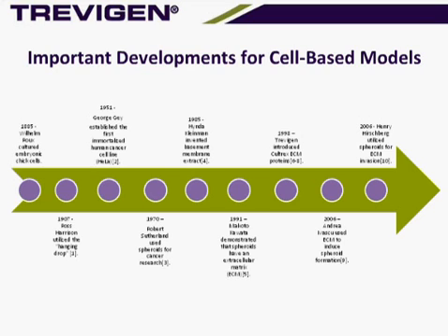Next, in 1985, Hynda Kleinman invented basement membrane extract, also known as Matrigel. This is one of the most commonly used reagents for organotypic cell models. It's extracted from the Engelbreth-Holm-Swarm tumor, which is propagated in mice. This extract provides a full complement of soluble and insoluble factors for the tumor or tissue microenvironment. It is also relevant to our model because we use a lot of these tissue extracts here.